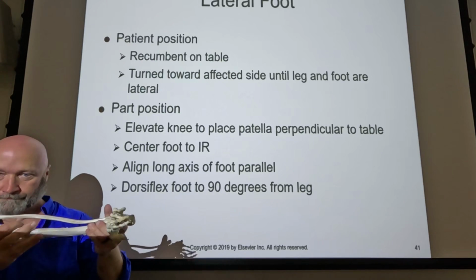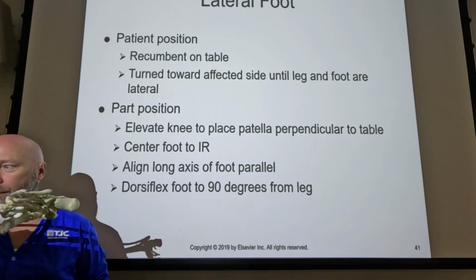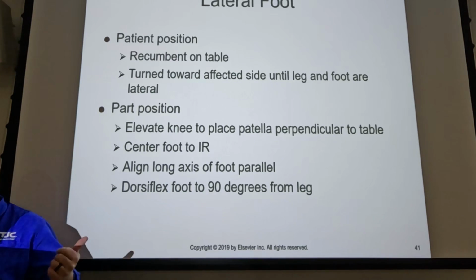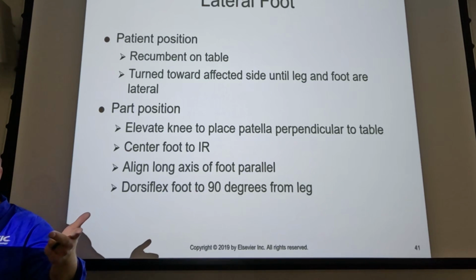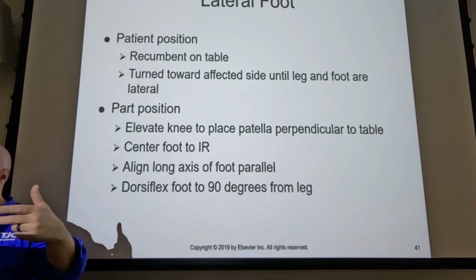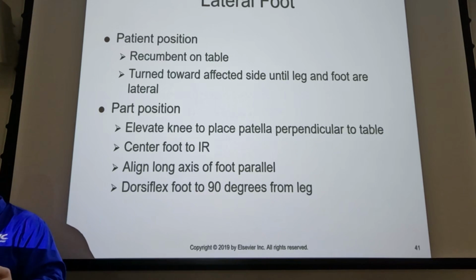Yeah, put the medial side parallel. So if you put the medial side down on the image receptor, guess what it is? It's parallel, right? Okay, so that's number one. You might see a question on a test, and this applies to foot, calcaneus, and ankle, all three, and that is that the lateral medial projection consistently provides a better lateral. It's pretty close to the wording that you may see. Okay, as for that reason.